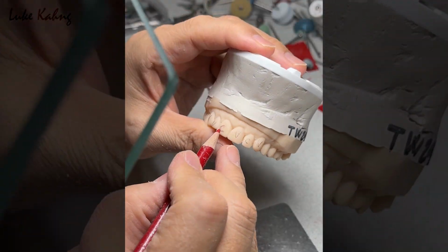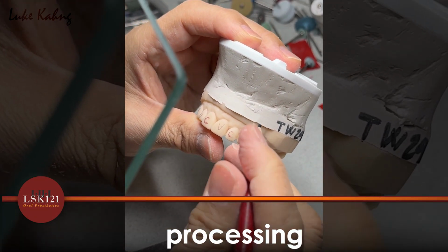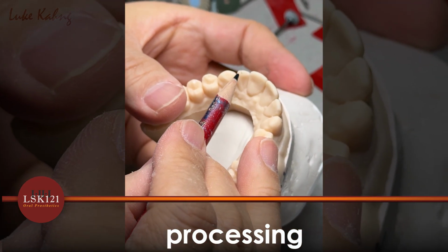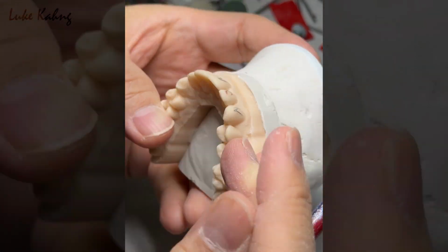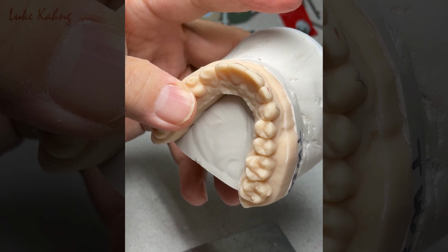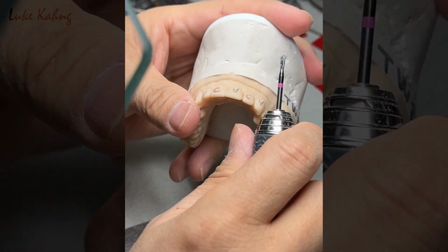So this is a crown. This is a crown. This is a veneer. It's like natural teeth. Veneer, veneer, veneer. So now prep the teeth. So this is a bulky crown. I'm trying to bring it in with a crown prep.